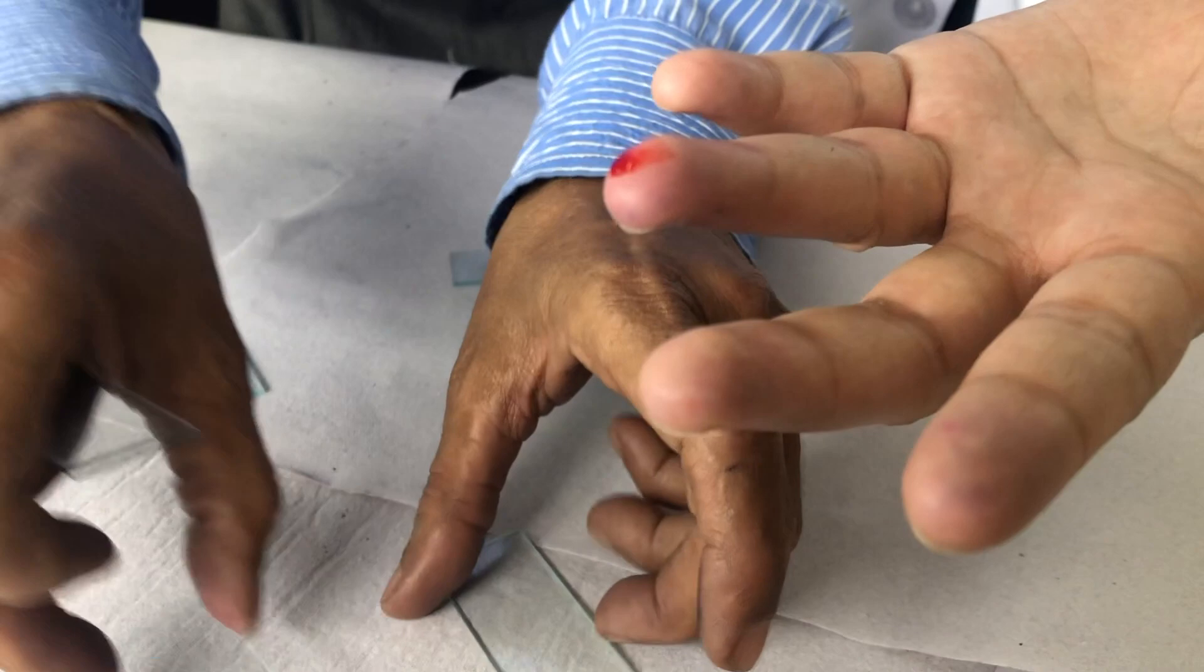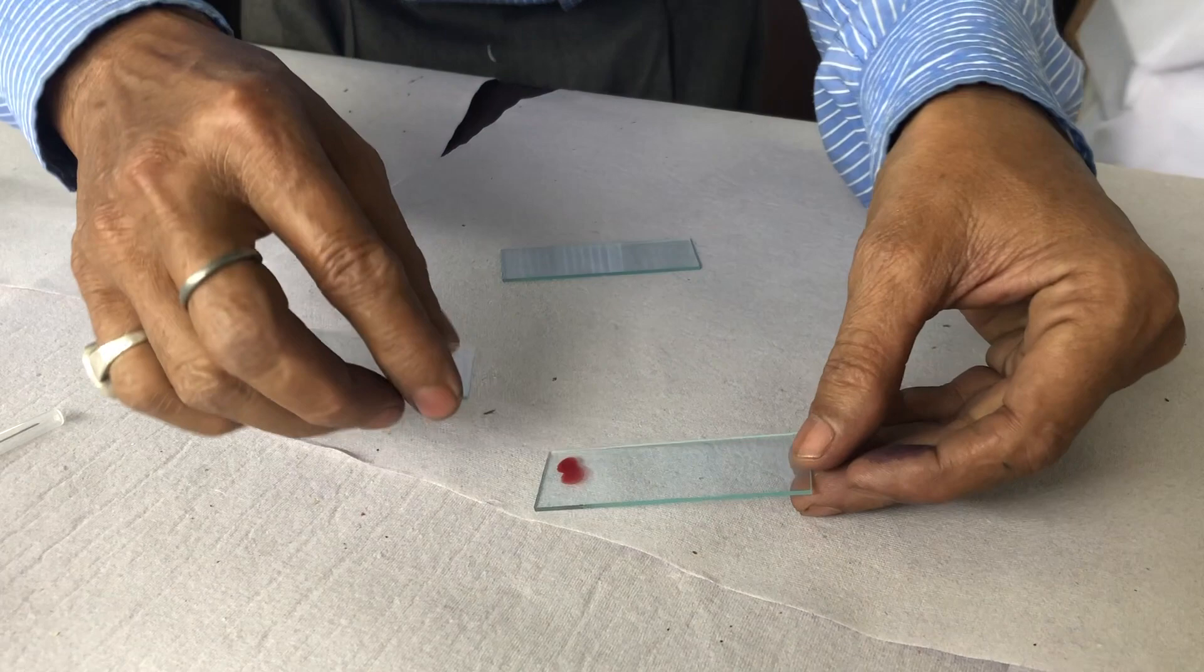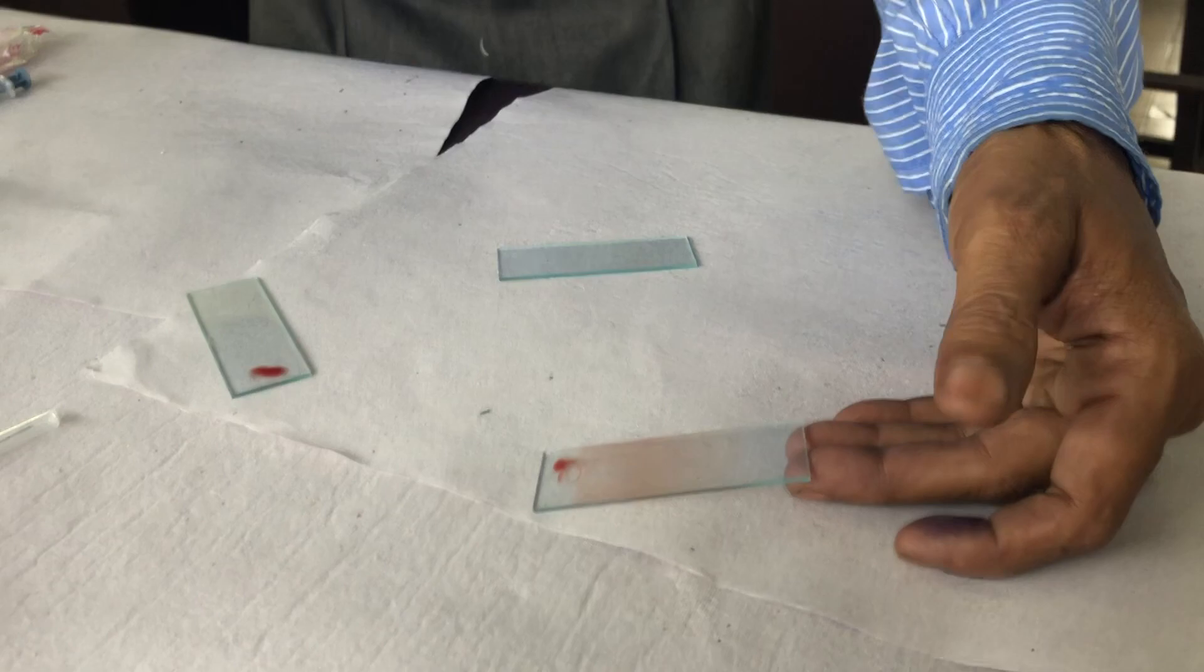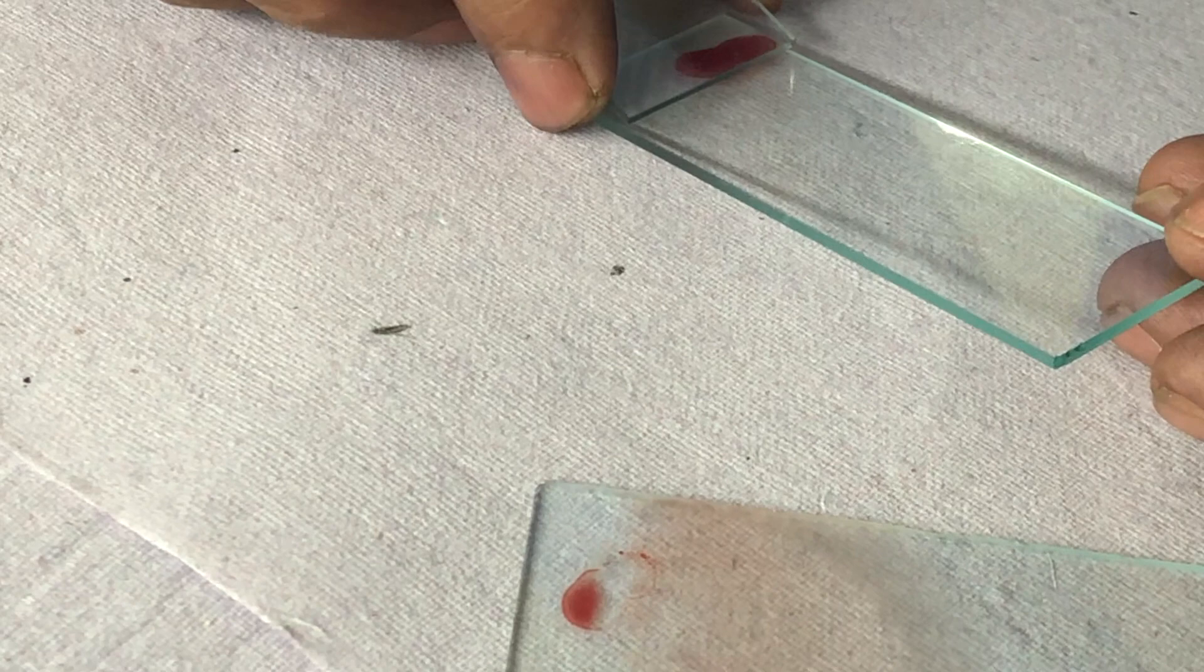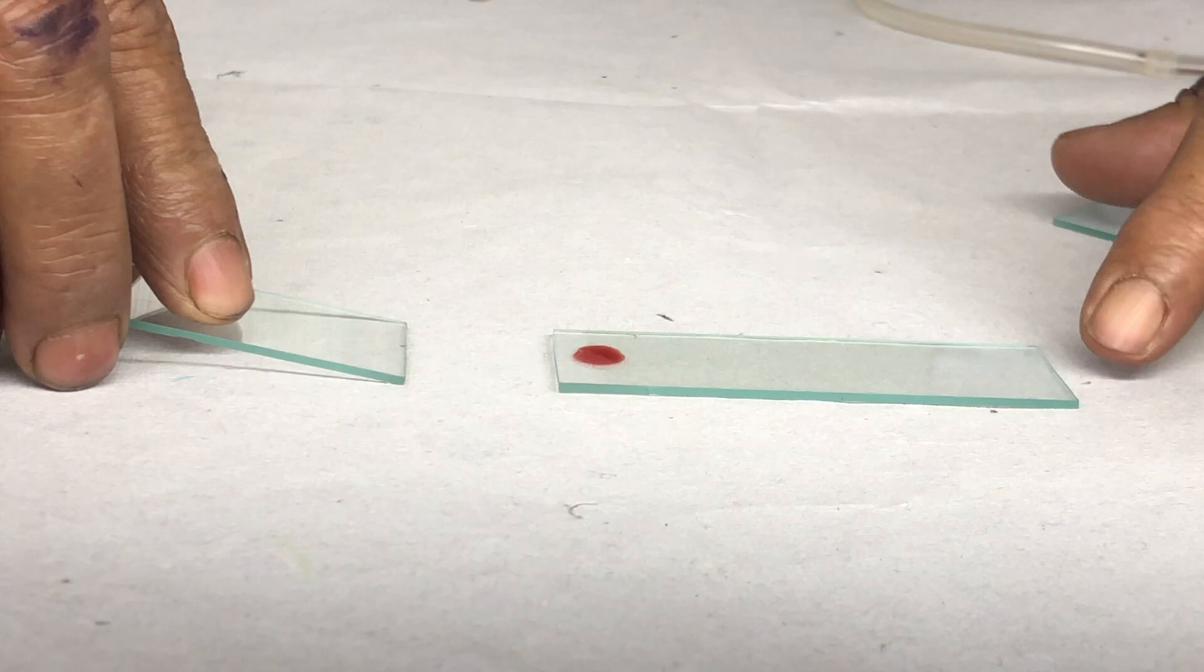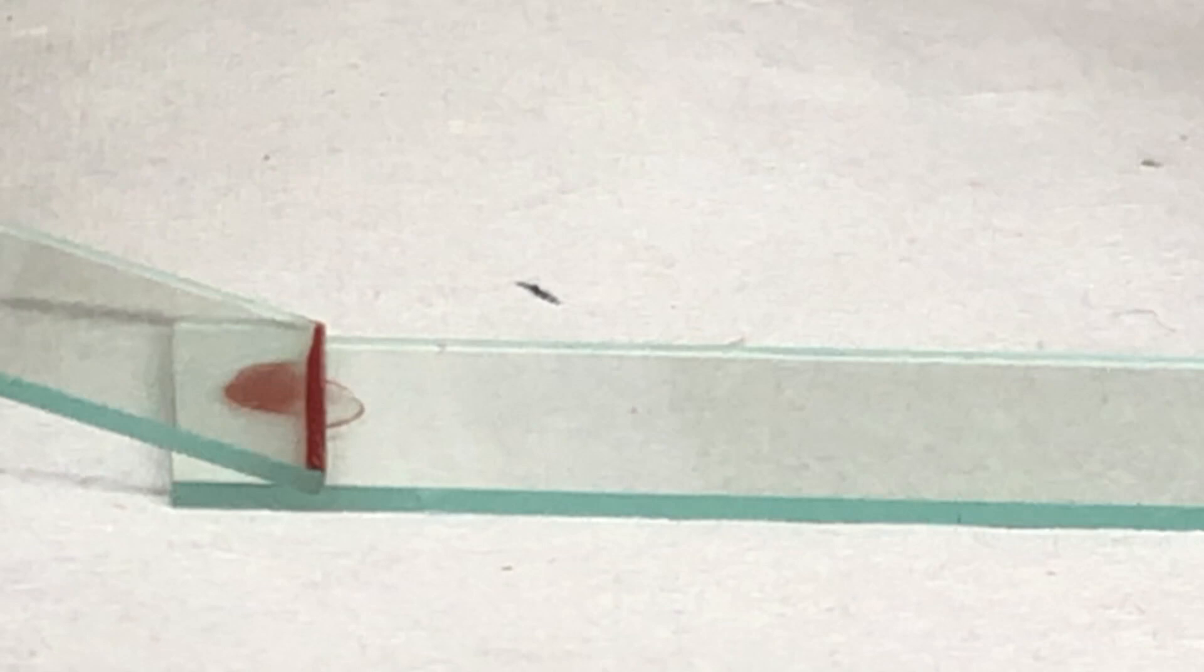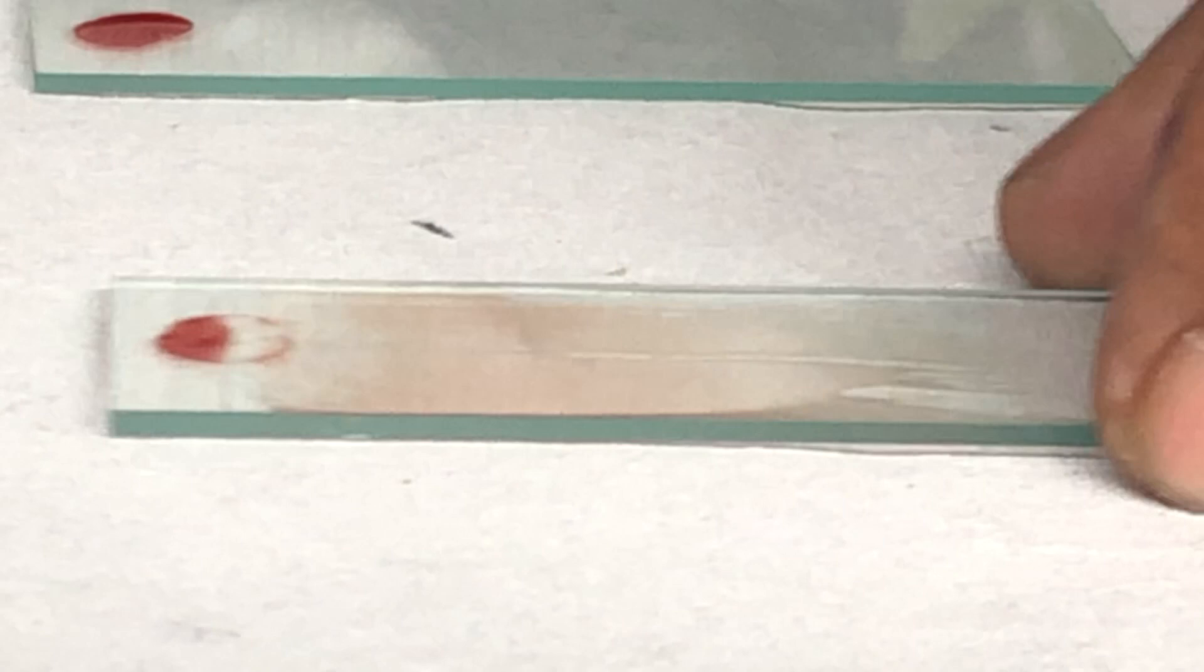For making the smear, always keep the slide and draw the blood with the spreader and then push it. So, here we go.